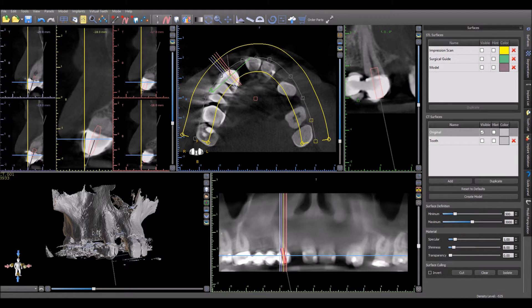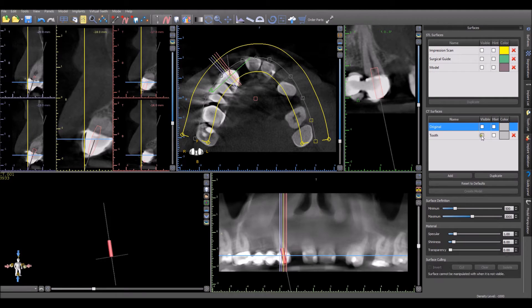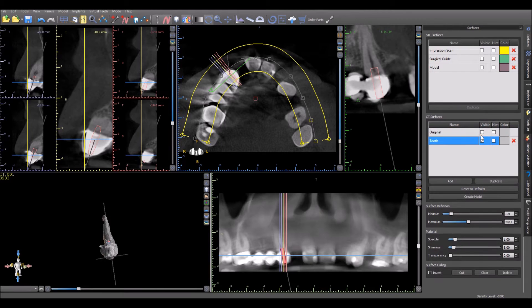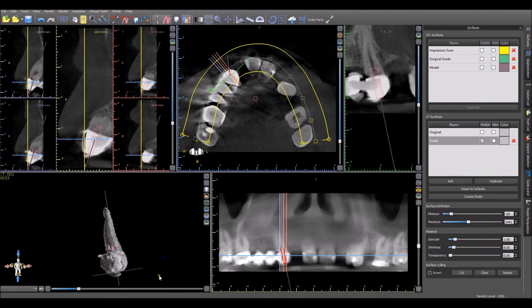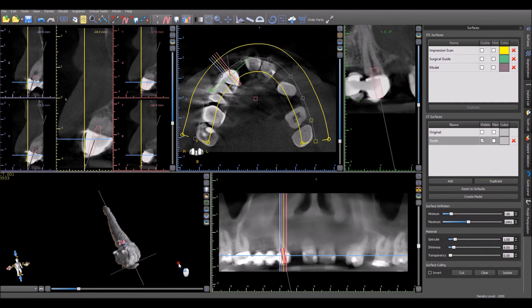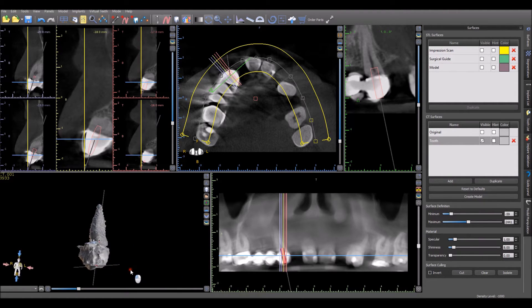If you would like to isolate the relevant tooth, this can be done easily by duplicating the relevant CT surface and using the isolate or cut tools to remove all other relevant teeth and anatomy.